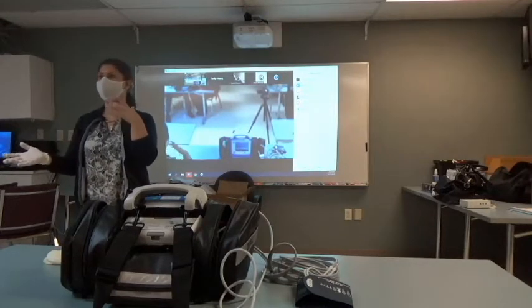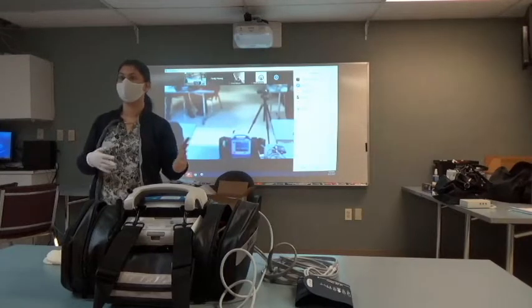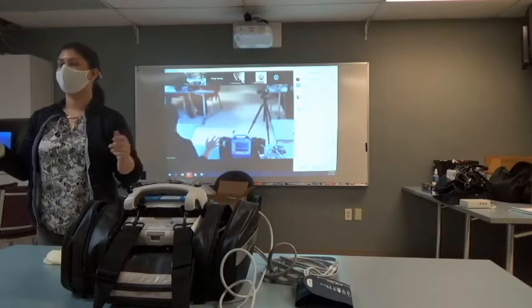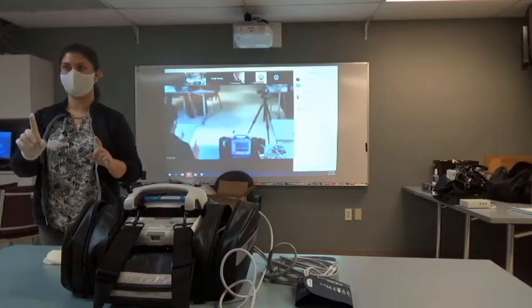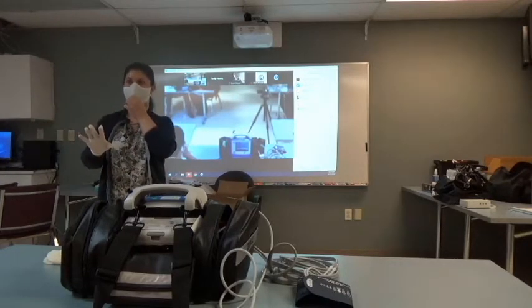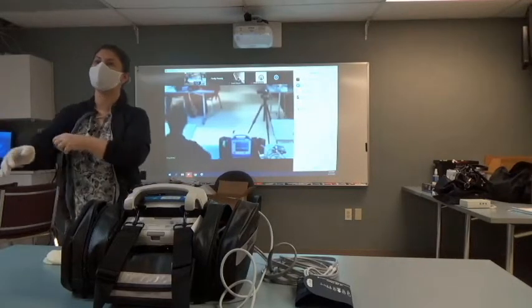So if you guys don't have a protocol that requires you to put things in two or more leads, then you guys are good. You should be good to go with that. Are we okay, or do I need to? Is that a configuration that we can change later? Yeah, you can, but there's also a manual.